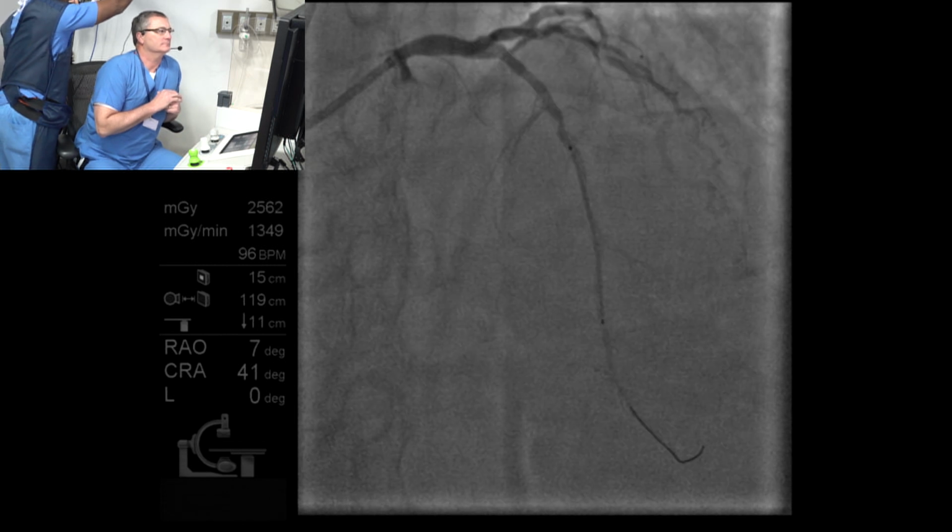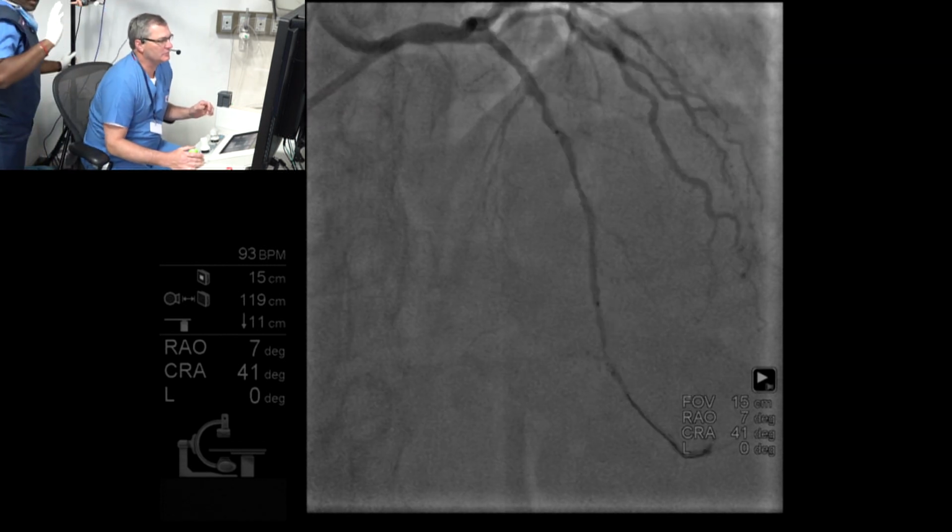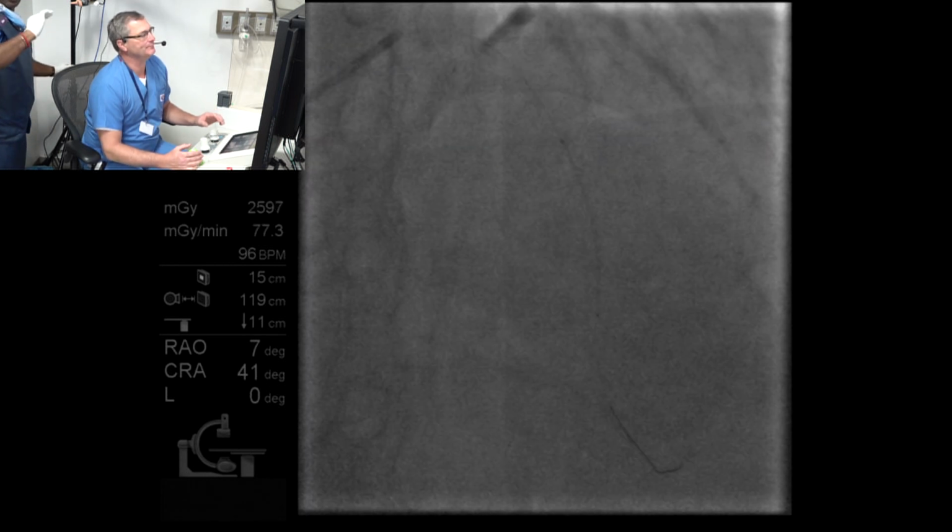Excellent. Okay. You want to have a taste? Yeah, another cine test. I think I can come back a little bit. Ready? Yeah. We'll cine, guys. Cine. Well, we can come way back. I'm going to have to pull my guide back a little bit because this is really going to suck that guide in.